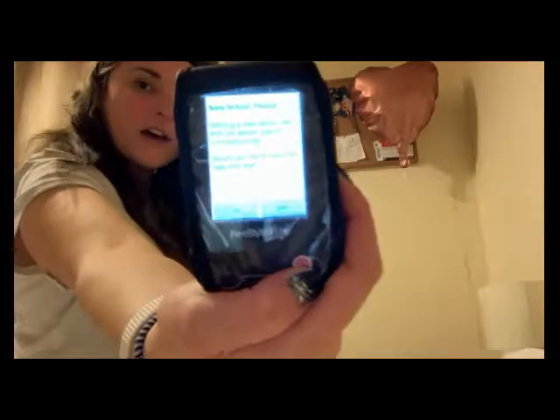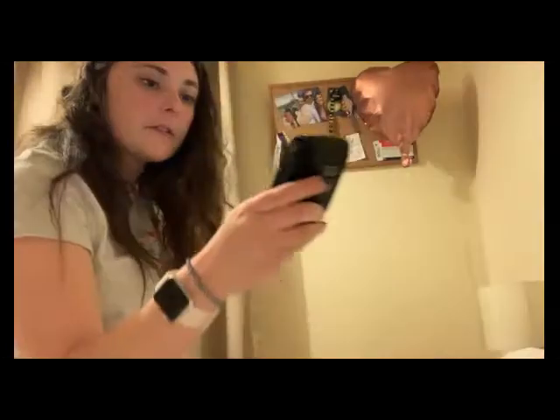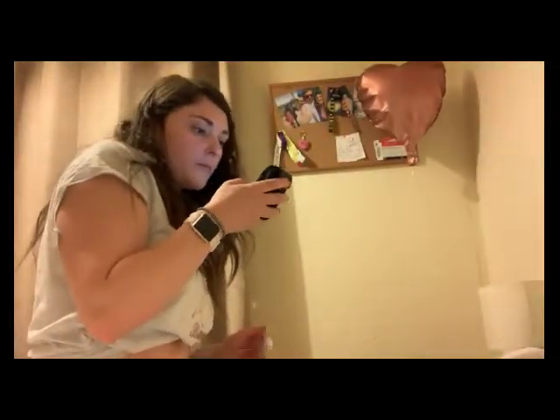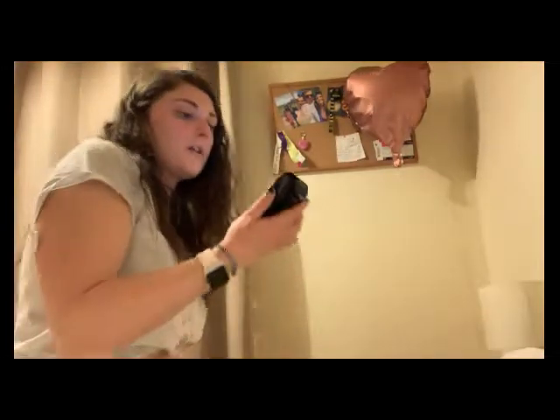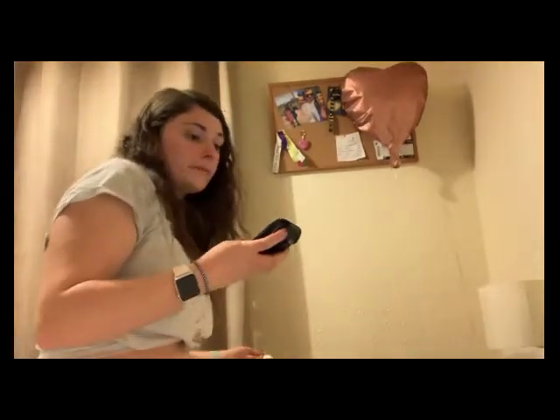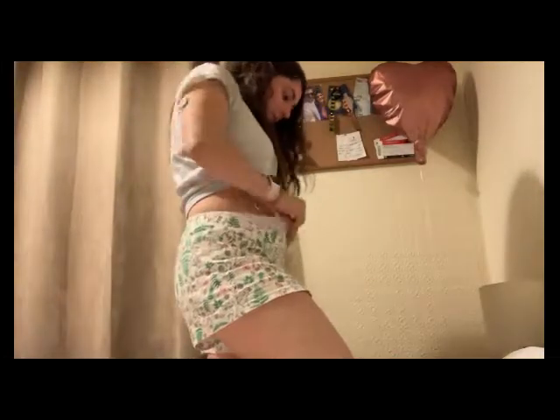New sensor found. Do I want to pair it? Yes I do. Right, need to rescan it. 60 minutes startup time. And it says it in the top corner. Sorry guys, you can't really see it so well. But yeah, so that's it. Brilliant. And I'll show you what I mean when I might as well put it on now, so I can show you guys what I mean.